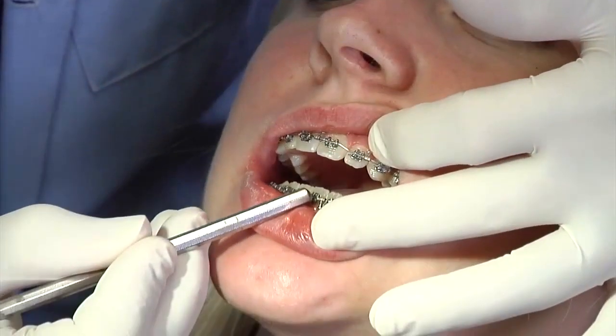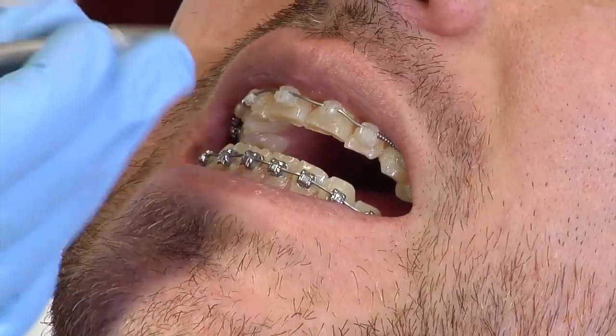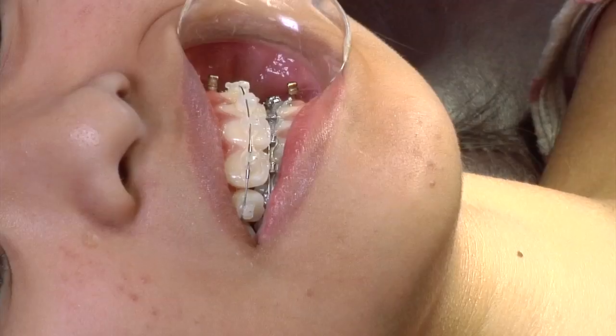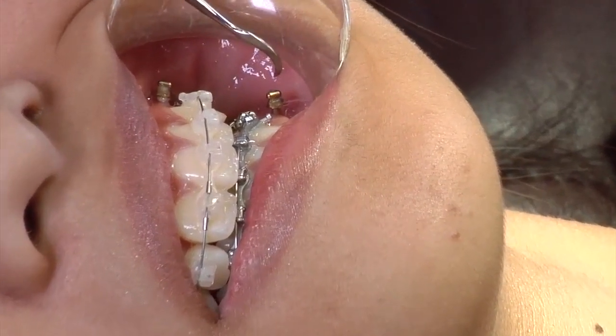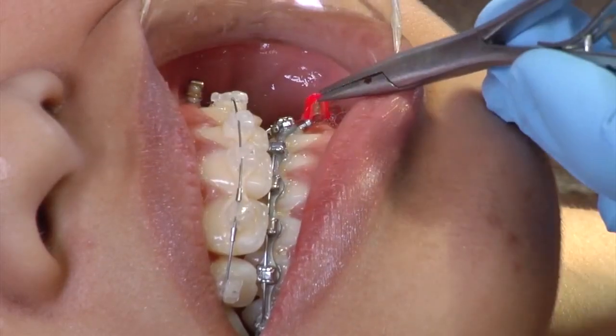Orthodontists can work wonders with rubber bands, little pieces of metal, and sometimes headgear to move teeth. But for certain adjustments, a revolutionary titanium device called a TAD helps the orthodontist apply force in just the right direction. This video explains the use of the TAD.